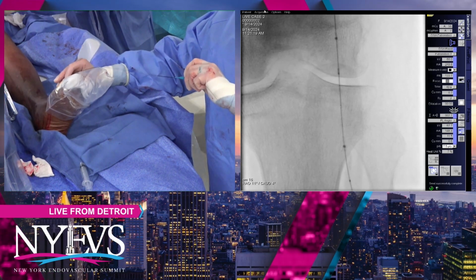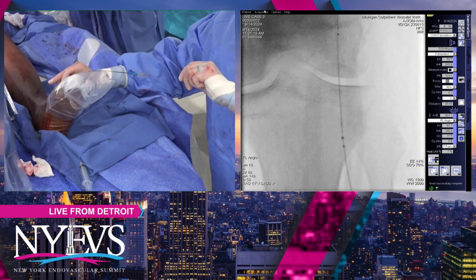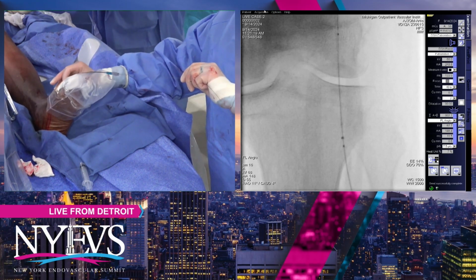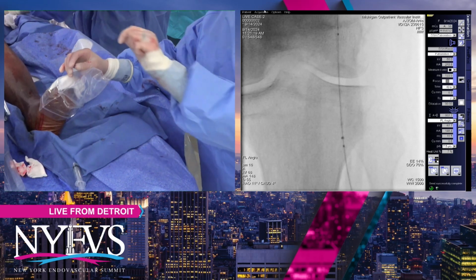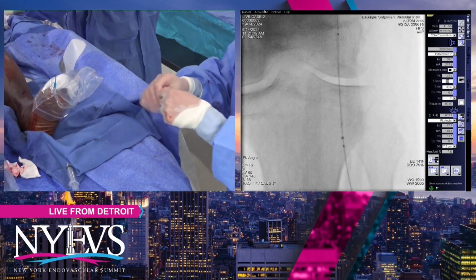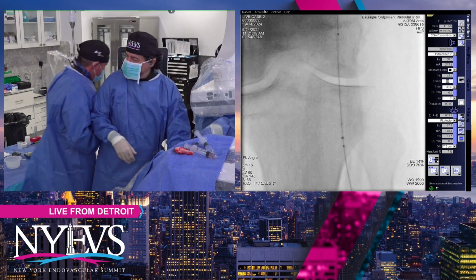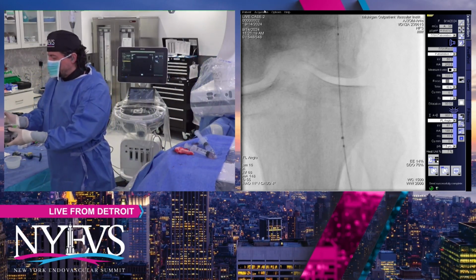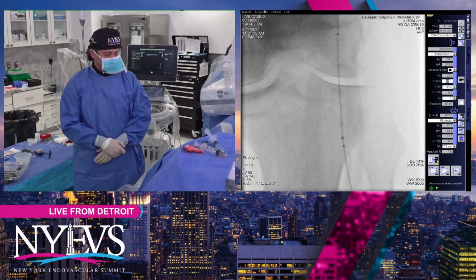See, I'm just the dumb cardiologist, so I always say that smarter people would have quit sooner than I have. So I usually try a little bit longer than I should. That's the problem. I guess knowing where the limits are, I mean, respecting the collaterals, not going subintimal unless, I mean, you'd rather do a retrograde than to dissect like 20 centimeters subintimal, right? I mean, you need a cheater?